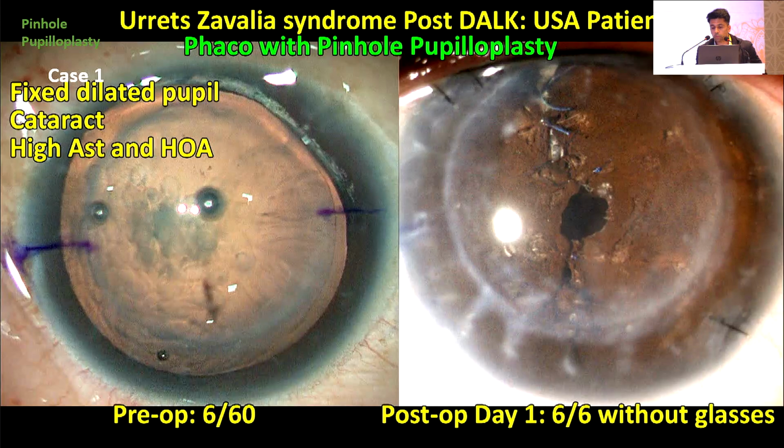And this is, guys, post-op day 1 without glasses. So this is post-op day 1, the post-DALK patient, which I would otherwise have had to do a complete PK. And that's what we try to avoid in this case.